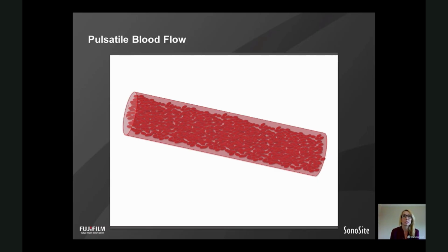So if we look at the anastomosis on a native fistula, that creates some resistance and turbulent flow as the blood flows around. And then a nice straight segment vein like here or an artery, we tend to see more laminar flow, where the blood cells tend to run in a nice laminar line.